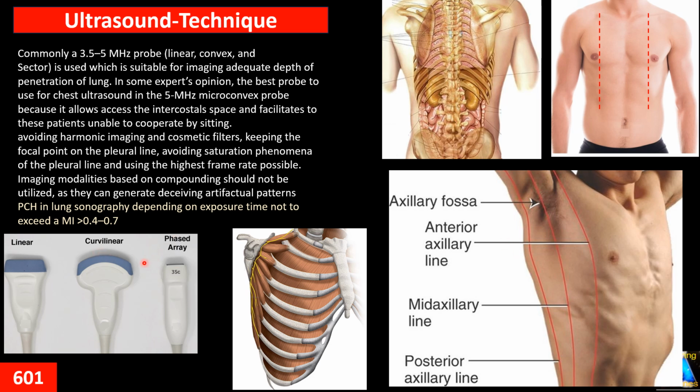So for that reason, we have to set up in a specific way if we use phased array, because as you know, with phased array or echo probe, usually we use harmonic and we use compounding. In that situation, when we scan the lung, if we have a setup in our machine, it's better we use the lung setup.